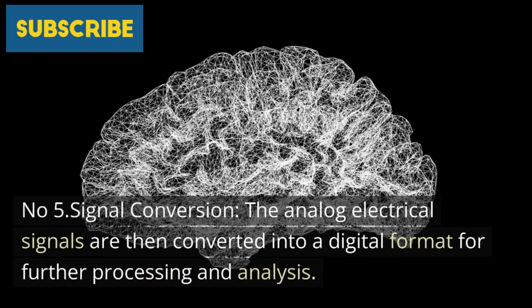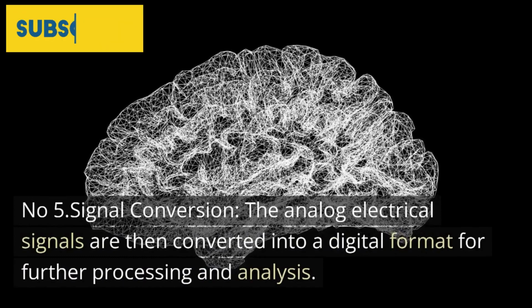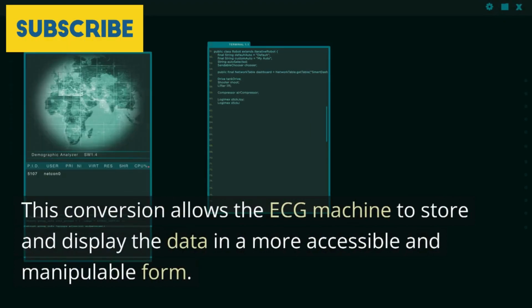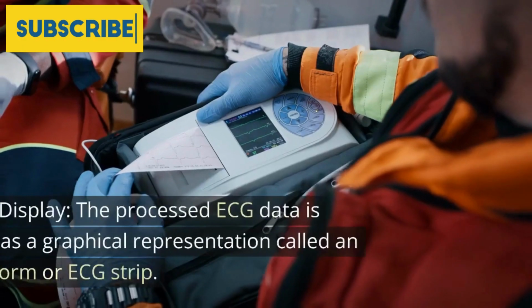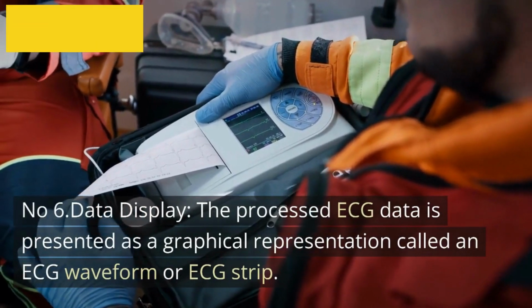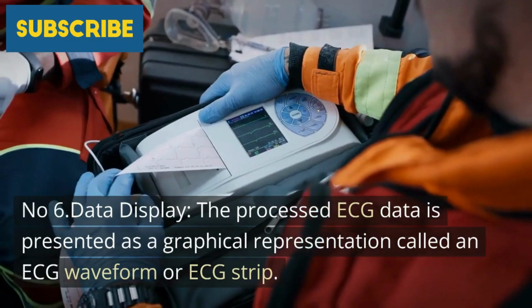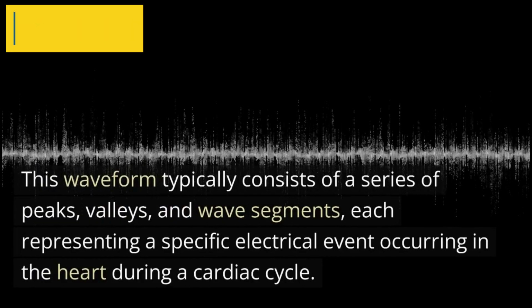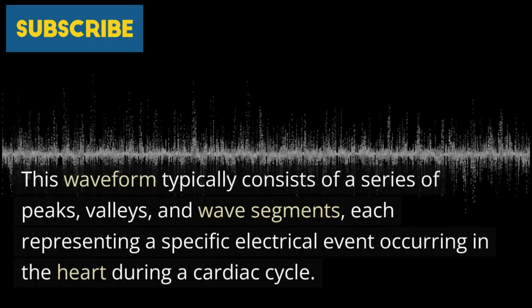Number 5. Signal conversion. The analog electrical signals are then converted into a digital format for further processing and analysis. This conversion allows the ECG machine to store and display the data in a more accessible and manipulable form. Number 6. Data display. The processed ECG data is presented as a graphical representation called an ECG waveform or ECG strip. This waveform typically consists of a series of peaks, valleys, and wave segments, each representing a specific electrical event occurring in the heart during a cardiac cycle.